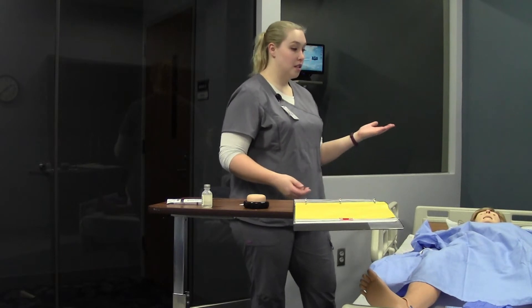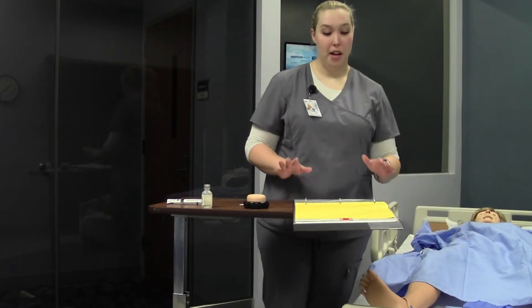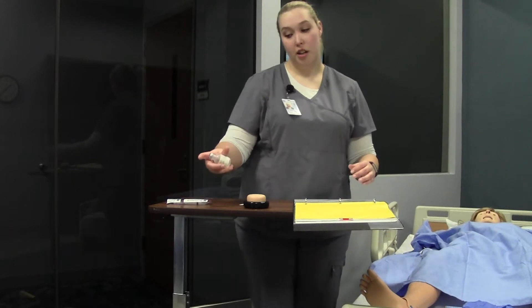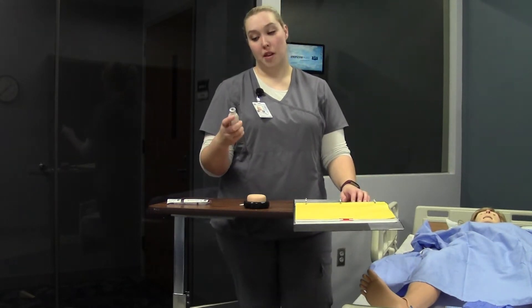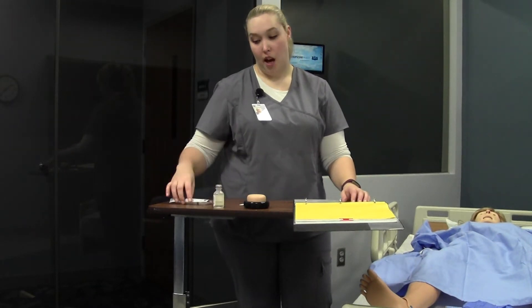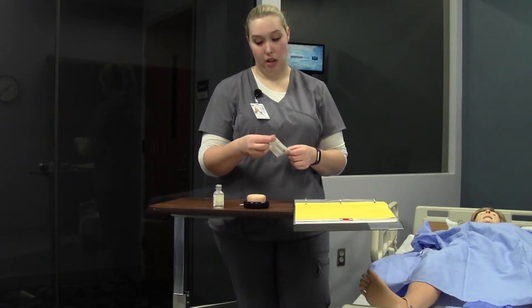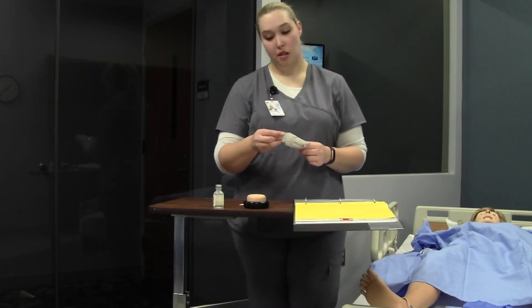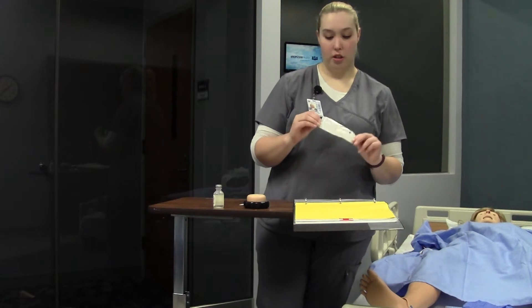So make sure you can position your patient. We're going to perform our check again to make sure that we have our 5,000 units. I've got the correct needle, so I have a 3 mL syringe with a 25 gauge needle and a 5/8 inch long needle.